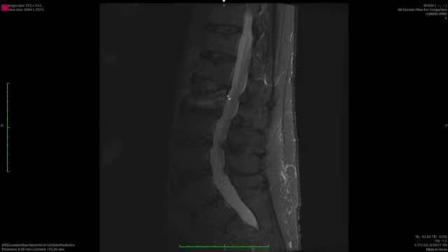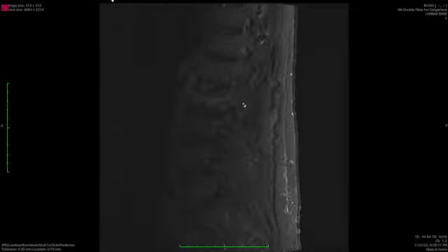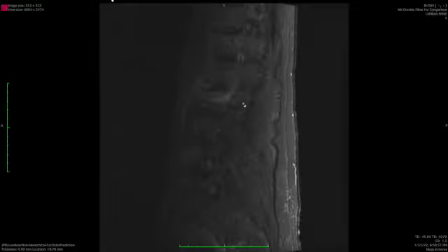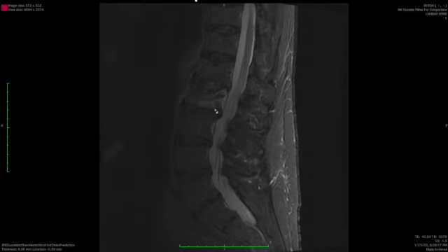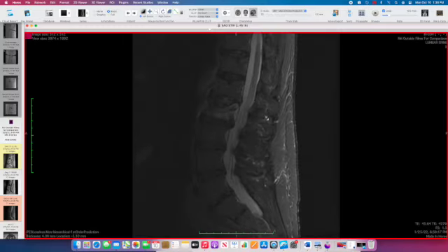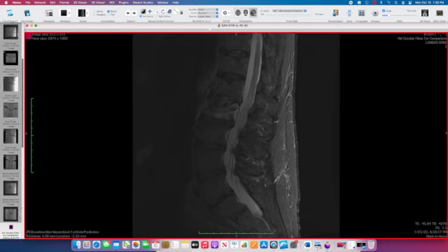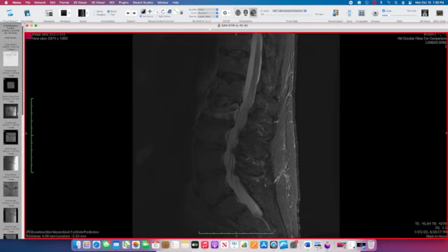We also look for things like posterior displacement of fracture fragments. It's not an absolute contraindication to doing the procedure, but it's something we'll watch out for, because if the posterior wall is not complete there's a higher chance that some of the cement we're going to inject could come back into the spinal canal, which is certainly something we do not want. So those are our diagnostic images and then we can go to the procedure images.